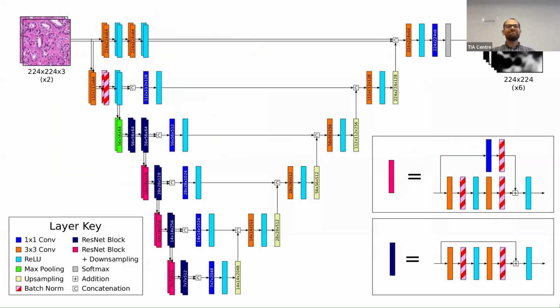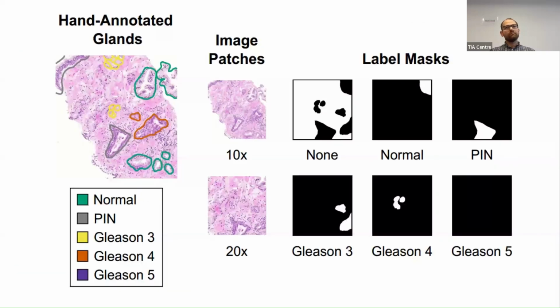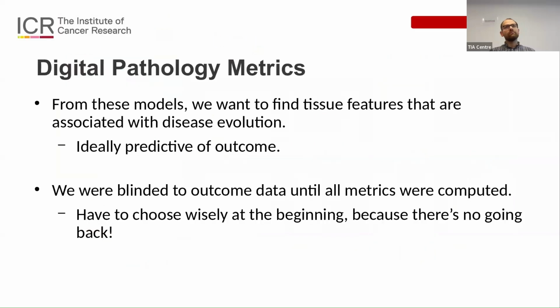And as I say, this is built on ResNet layers in the encoding layer. And you can see at the end you get these masked regions, and essentially whichever class has the highest percentage per pixel is selected as the segmented region. And so yeah, that's basically a high level idea.